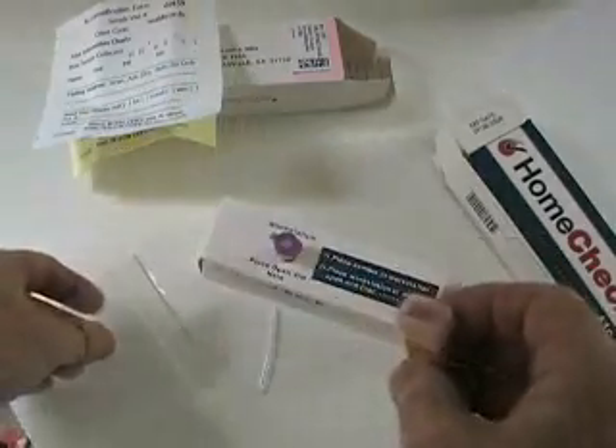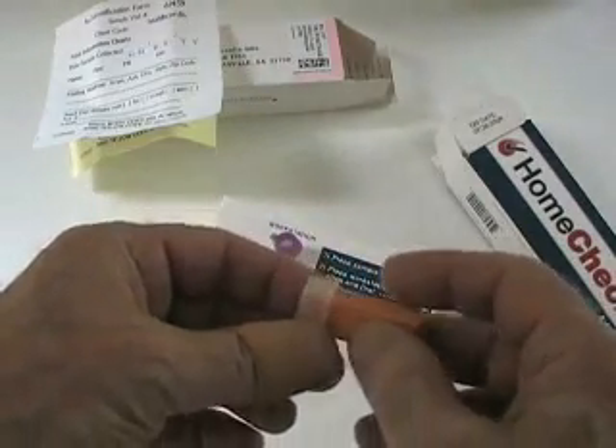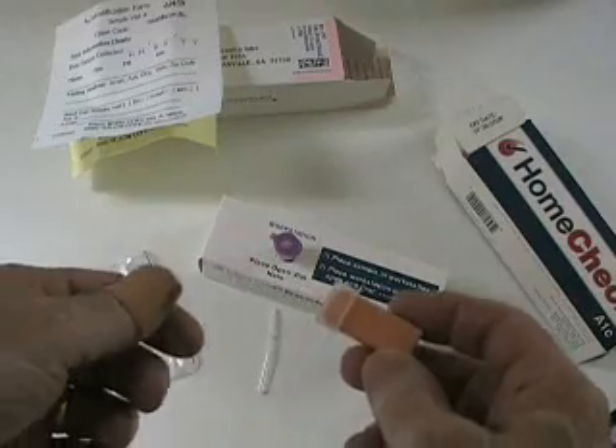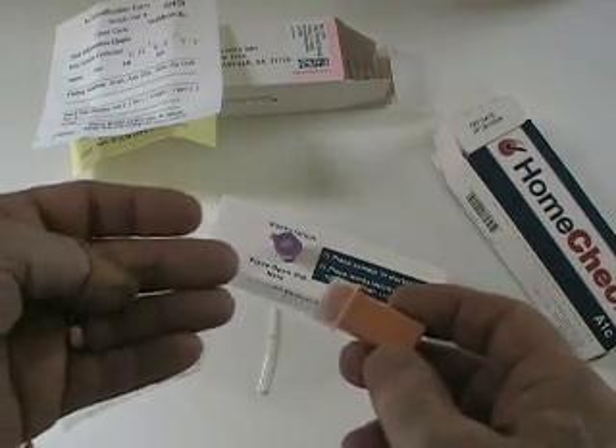I've used it before, and if it's the same as last time, I know it'll be pretty painless. One important note before doing an A1C check: please be sure to wash and dry your hands. I've already given them a good scrubbing because I was working out in the yard.